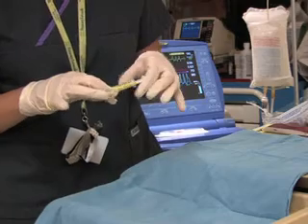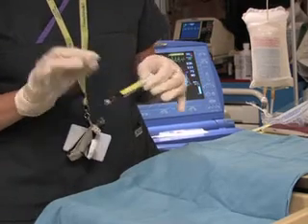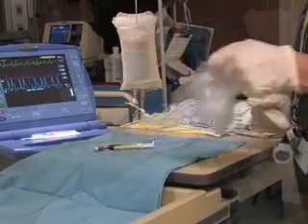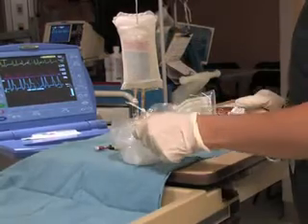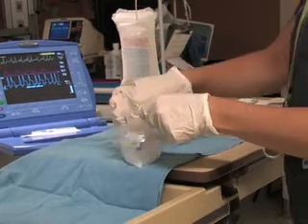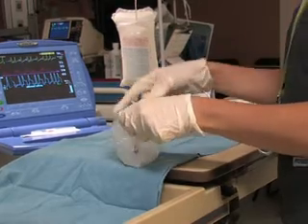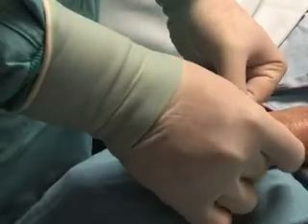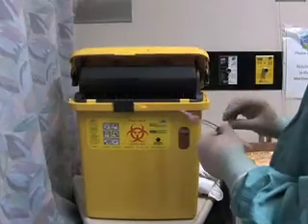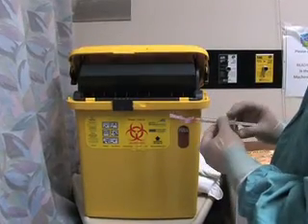Ensure that the syringe is labelled with the patient's name and unit number. Place the entire syringe in the bag of ice if transport to the lab is required. After pressure has been applied to the puncture site for 5 minutes, affix the gauze with some tape. Dispose of all sharps in the designated sharps containers.